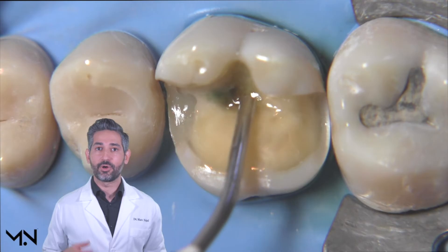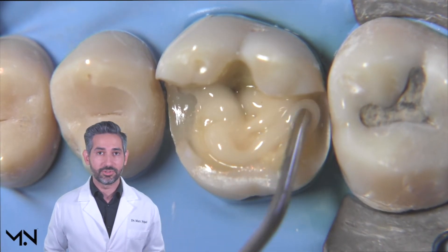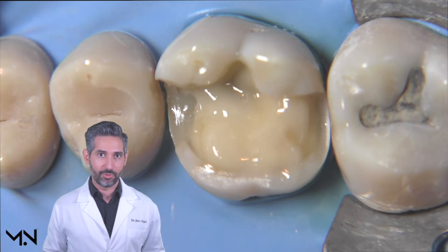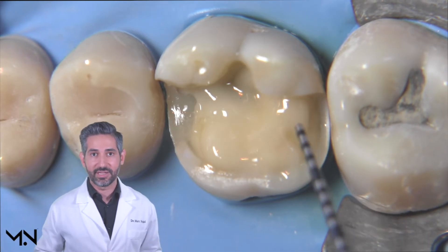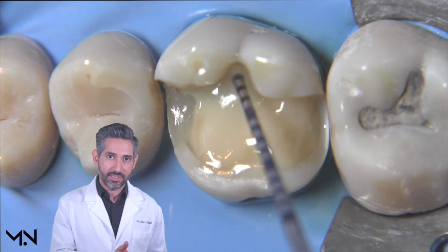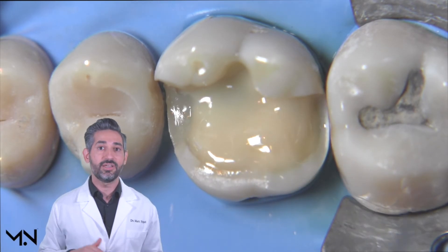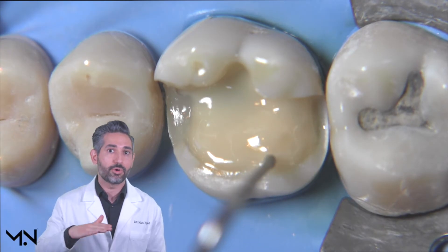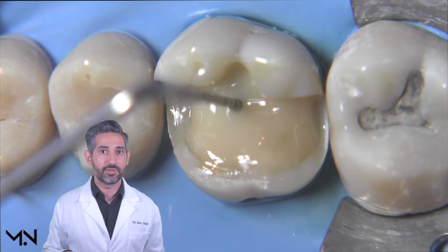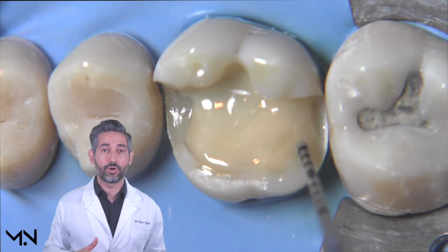After this first cure, we're ready for the step called resin coating. During this step, you take a layer of flowable composite — you want something with a high modulus or good filler content — and your goal is to cover the entire sealed dentin area with about half a millimeter of flowable. Cover about half of the dentin surface with flowable, then use a probe to drag the flowable to cover all the dentin right up to the DEJ. Verify with the probe's one-millimeter markings that you have somewhere between 0.2 and 0.5 millimeters, then cure a second time to complete the resin coating step.